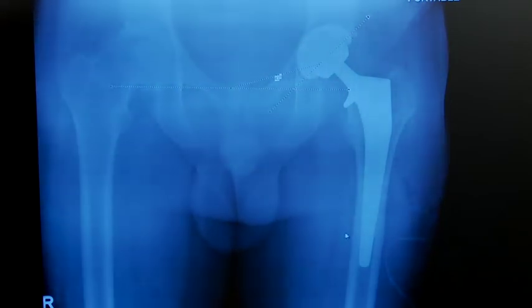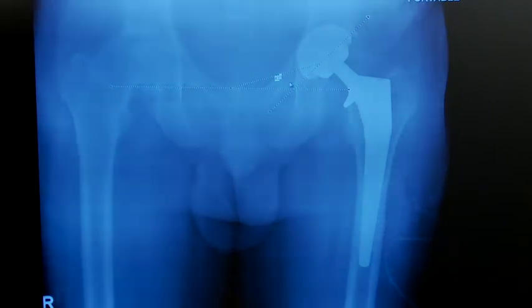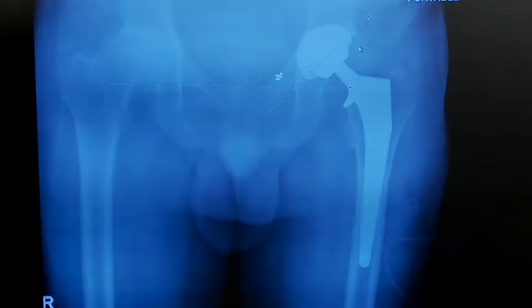I think my cup position overall looks good in terms of its depth. Maybe a little bit high on the cup position, but if you look at this image, this trans-teardrop line lines up with the top of the symphysis, so this is a little less of an inlet than he stands with, and as you get more inletty, the cup will drop down some, and so it may look more like where it should be with respect to the bottom of the trans-teardrop line. Nonetheless, I think his cup position is still very reasonable. He had quite a bit of superior wear, and so we were just trying to get the cup tucked into that to get some bite in the cup there.